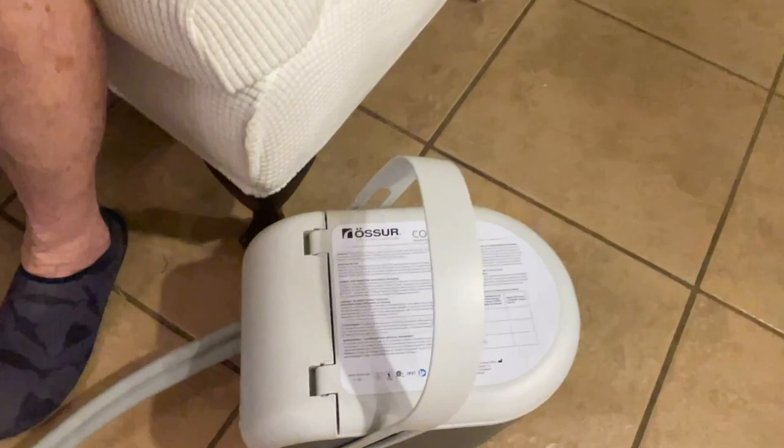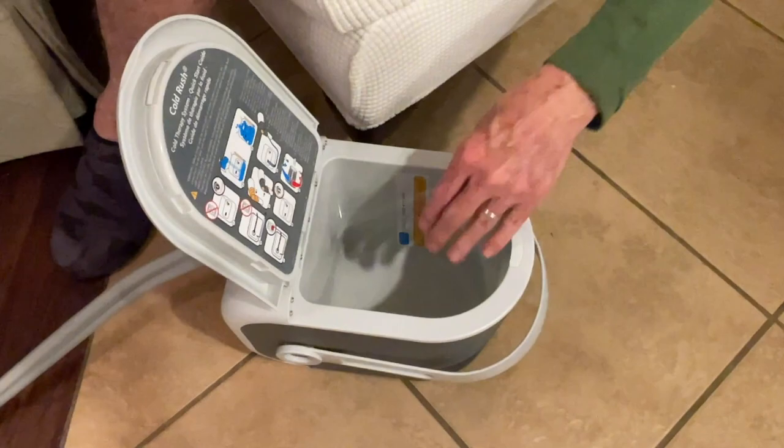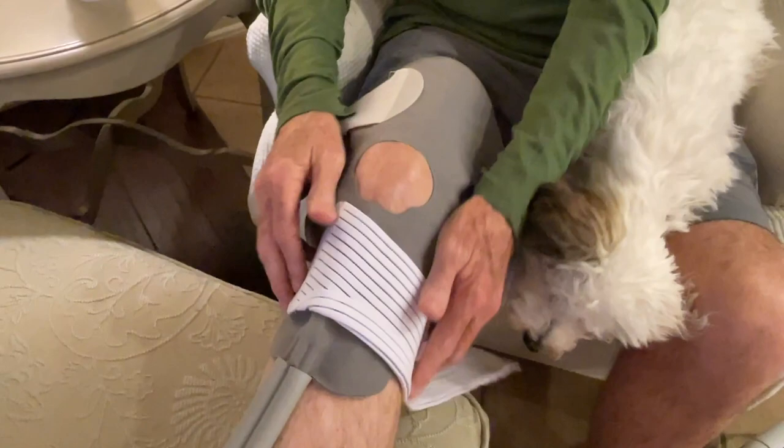I'm telling you, don't be without this OSSUR ice machine. I'd take little small water bottles, put them in the freezer, so I'd always have backups. I didn't have to put crushed ice — I'd always just leave a little bit of water in this thing and drop the bottles in, shut it, turn on the button, and it flows in and flows back out.